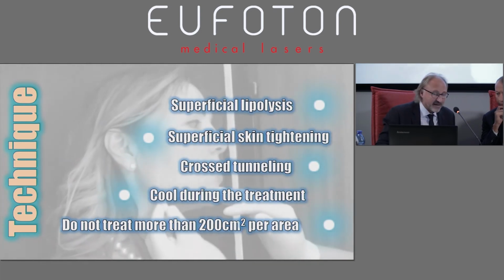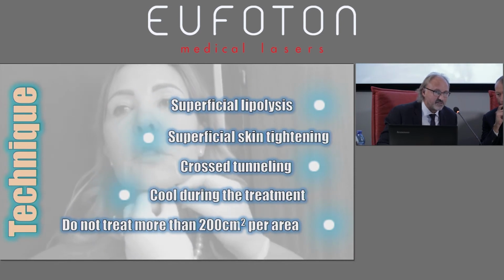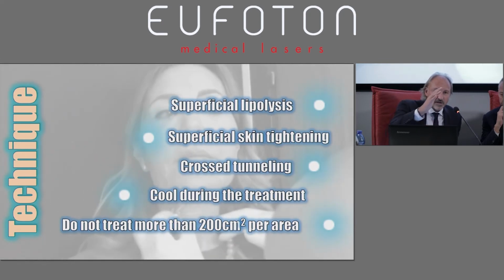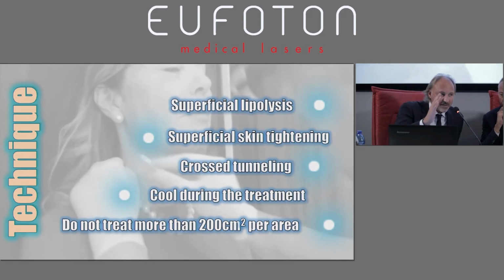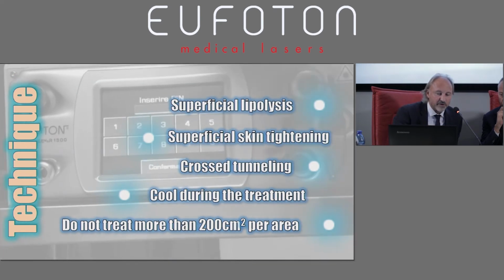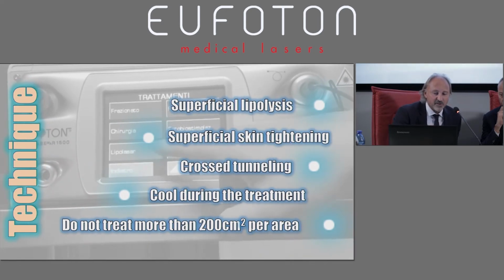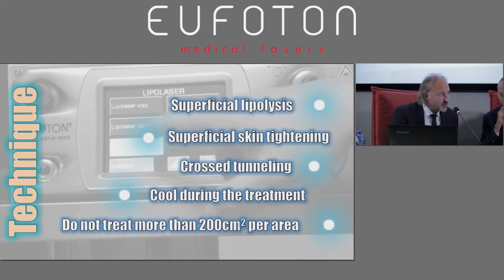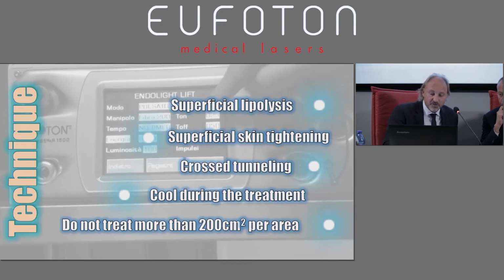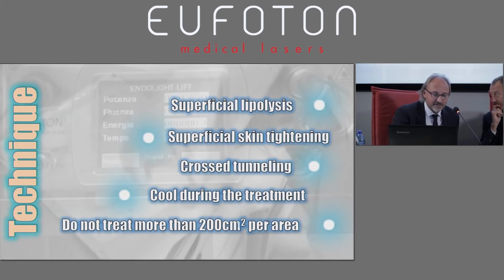Technique details, maybe we're going to talk about this when we're going to be live. I always prefer superficial lipolysis, since we speak of a small reduction. Superficial liposculpture with the laser is more effective than a deep one, because immediately this changes the profile, the contour. No way to go deep. The superficial plane is useful for the dermal stimulation for the body. I prefer crossed passages, but quite superficial always, or cross-tunneling. So cross-tunneling, as already said, cool during the treatment.